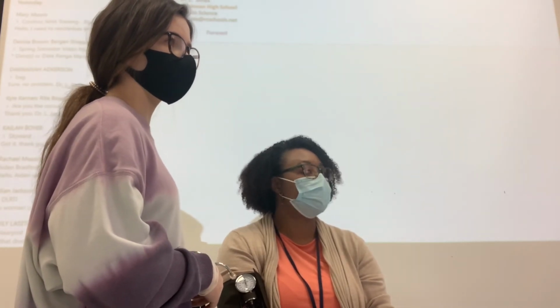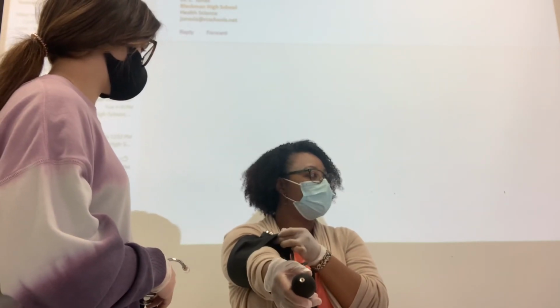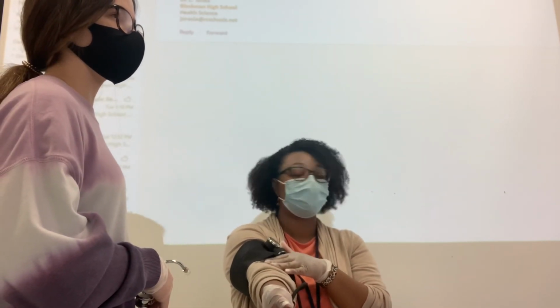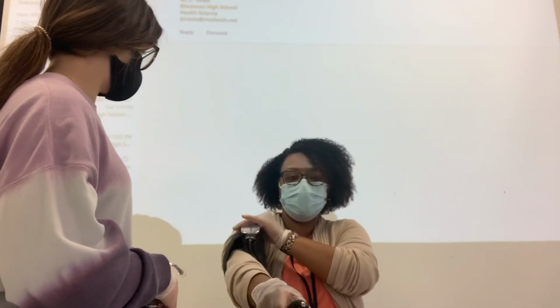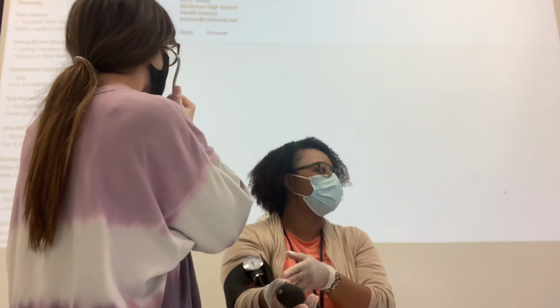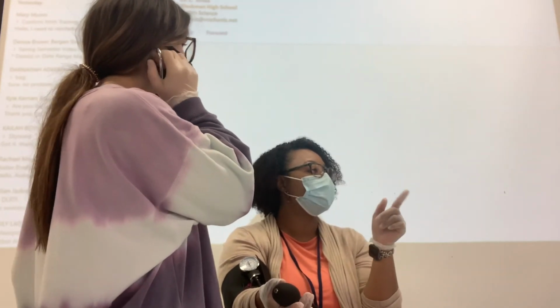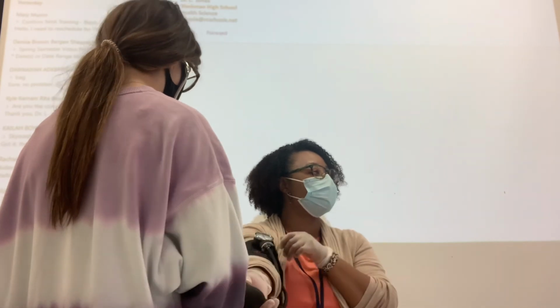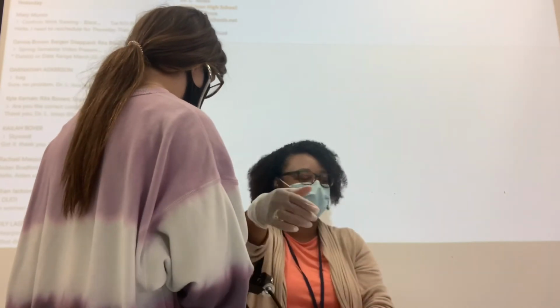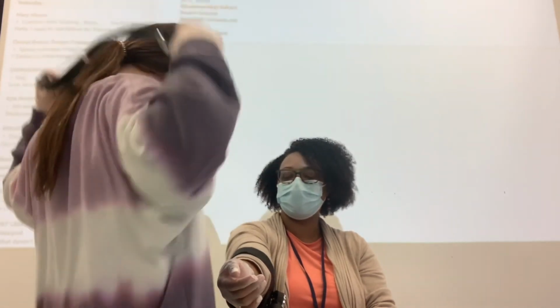Okay, so the sound is on. It's working. So you're gonna make sure you put it under the cup, right here where the artery is, so that you can hear. All right. So let's try it again. So this time, I want to see if you can hear something. And like Madeline, you may need to take your jacket off. It may be too thick for her to hear, but hers should be okay for you to hear. And if you can't, then maybe the clothing is just thick. All right, can you put it back on, please? And then we'll see if you can hear it.